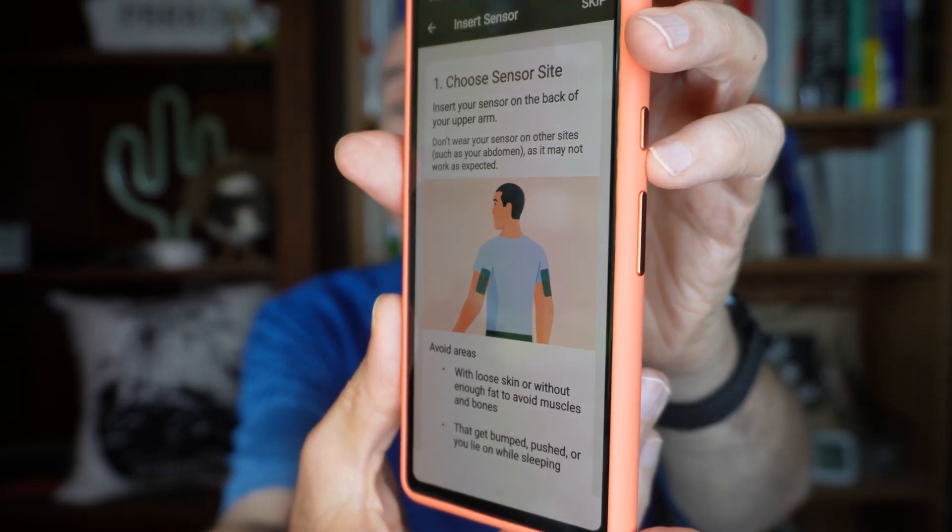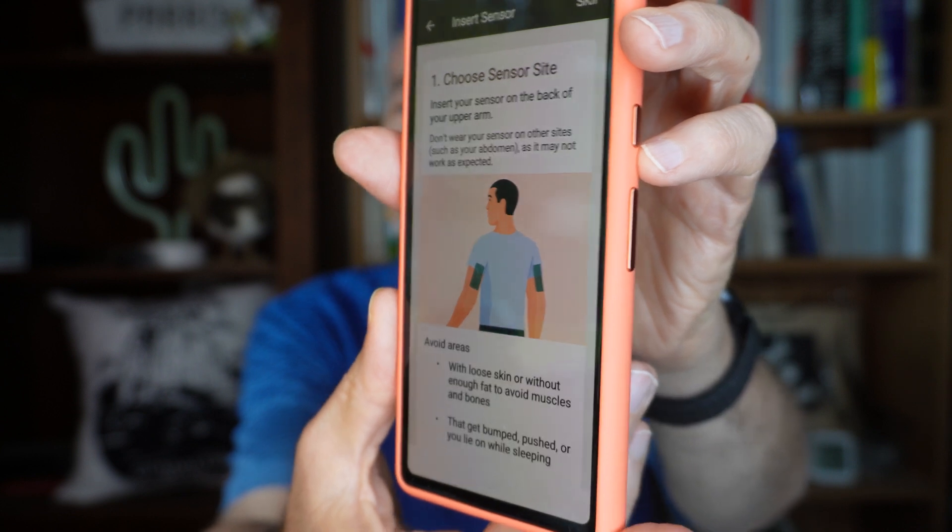I'm ready to get going with the applicator and install my device into the back of my left arm. I've gone ahead and shaved some back here to get rid of the hair. What worries me is where it says make sure to choose a spot that has enough fat so that the sensor won't interact with bone or muscle — sounds unpleasant. I used to weigh 275 pounds, I'm down to about 180 now, so this used to be no concern. Now I'm thinking, is there really enough fat on there? I think this is a good spot — this is what I'm going with.